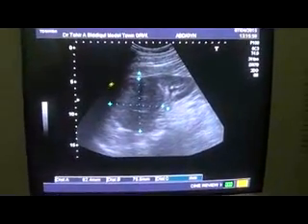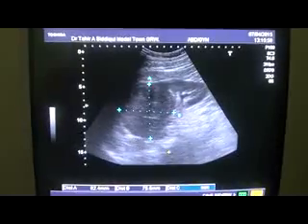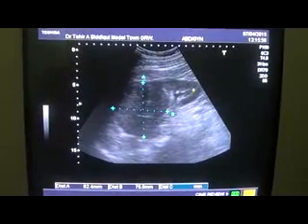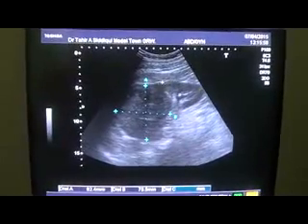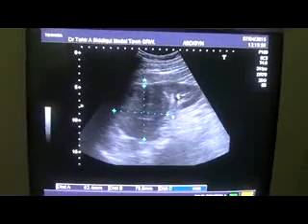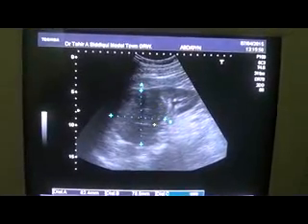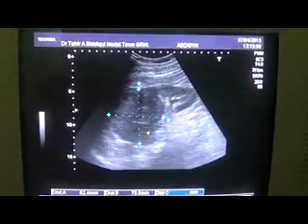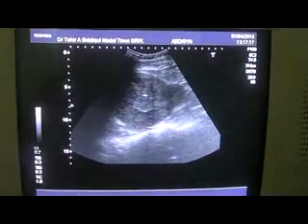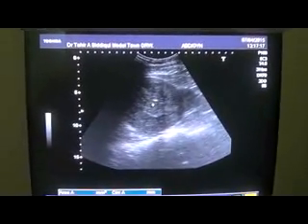It elevates the capsule of the kidney, and it's well demarcated. There you can see the wall. And this is the lower pole of the right kidney, which is a preserved part, with the mid region. These are the lower pole calyces. And this is a solid mass relating to the mid and upper pole of the right kidney. Now see the appearance of this. It has internal echogenicity, and this is the calcification, tiny calcification.